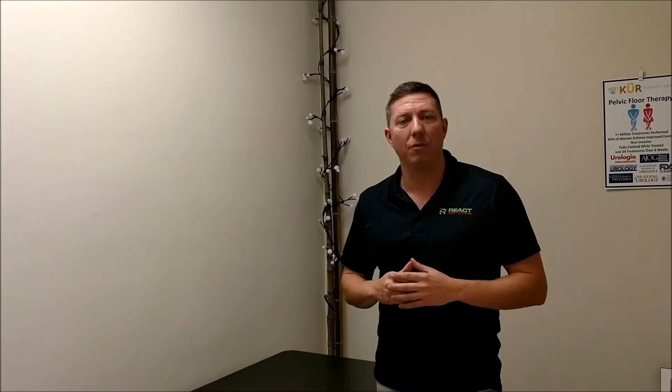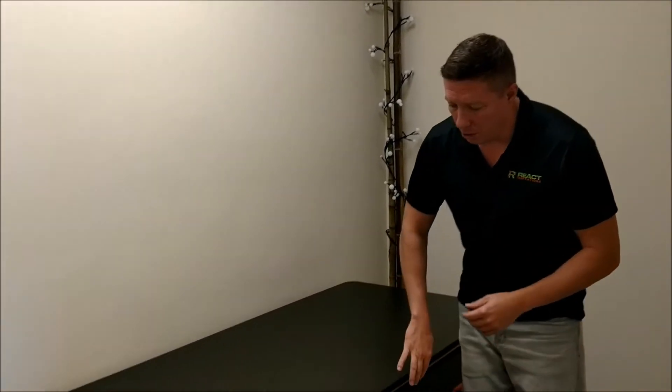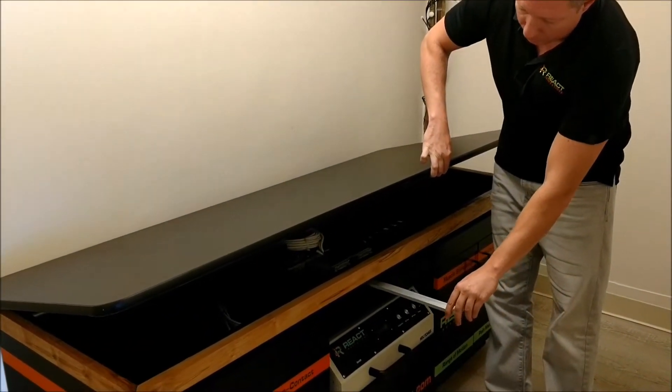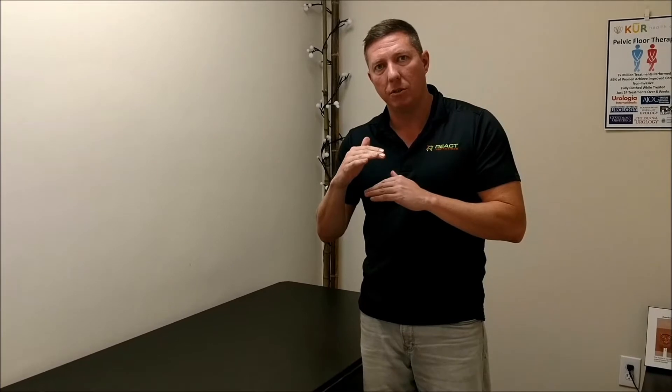We're excited to talk to you about our revolutionary bioelectric magnetic therapy. What you see here is one of our units — it's a table. Underneath the table you see our bioelectric magnetic head, which can go back and forth. That pulse actually shoots through wood, comes through clothing, and can penetrate up to four inches into the muscular structure.